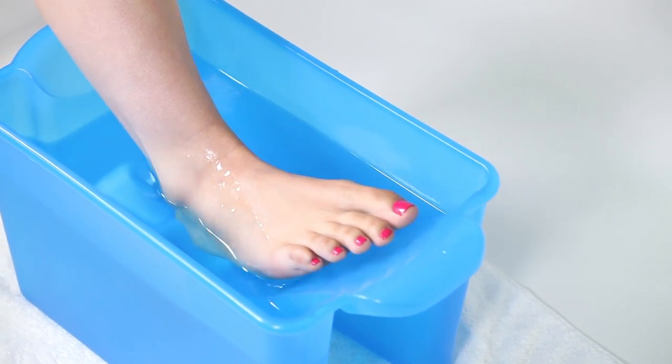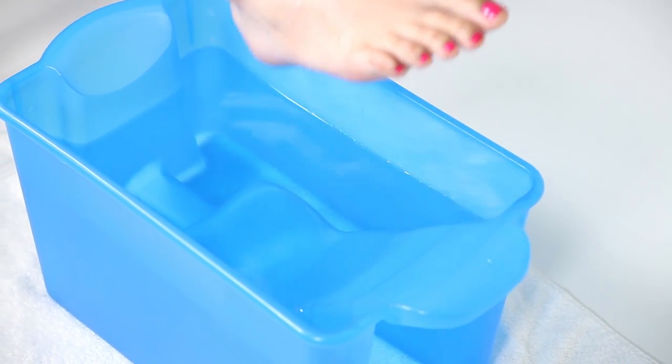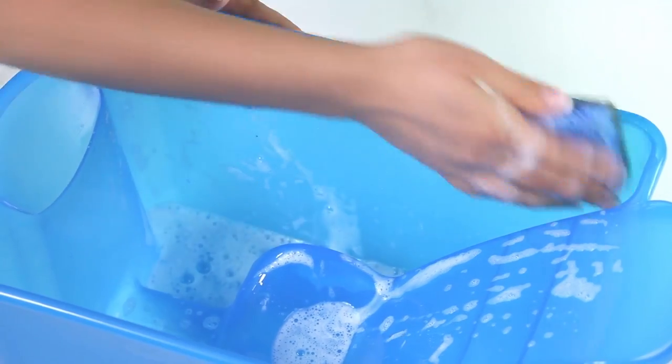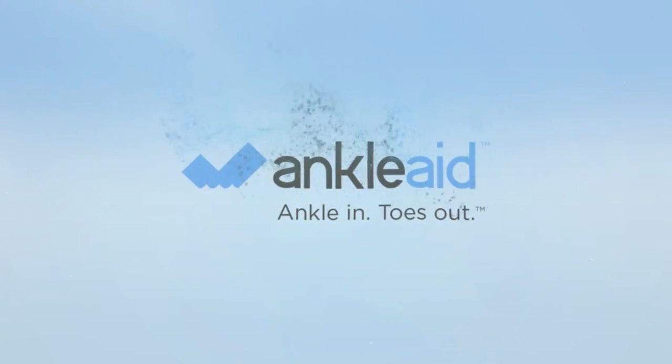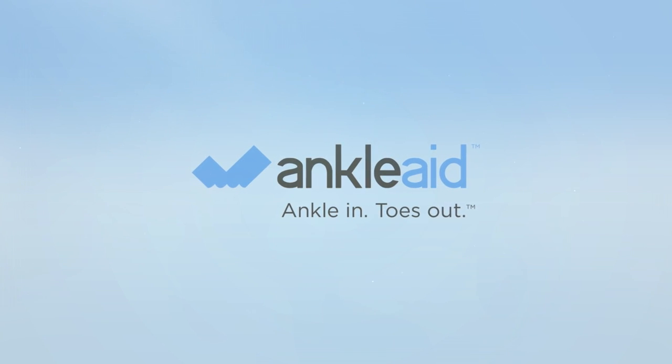Keep your ankle submerged for 10 minutes and levitate it out when done. Finally, remove the water and scrub down that fountain of youth. Your toes will thank you, and your ankle will heal comfortably.